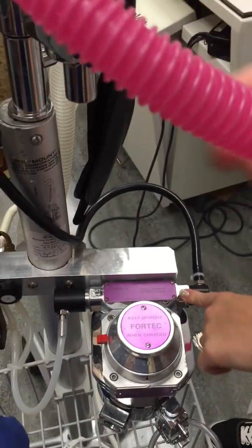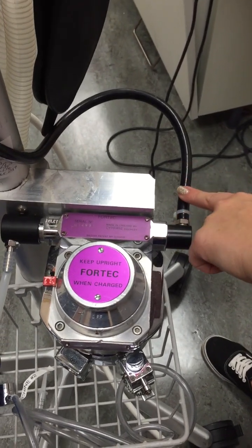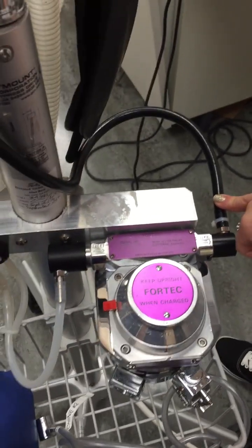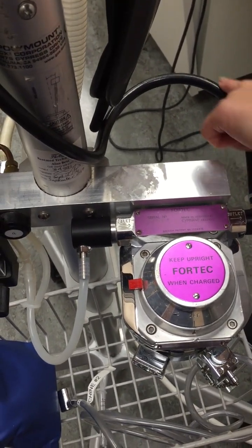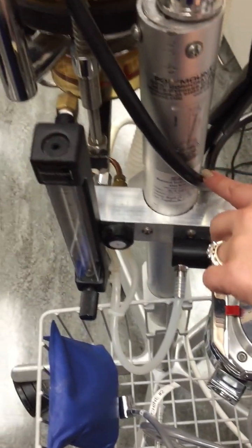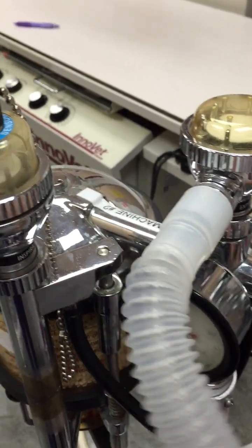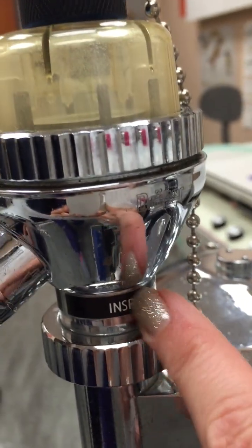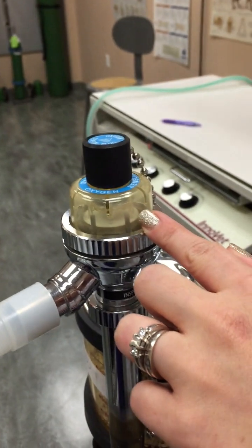All right, so from the vaporizer outlet, we are now coming and you have your fresh gas flow. So this is your oxygen and your isoflurane. You will notice your fresh gas flow come from this hose and come right up to this tube here. This tube here is your inspiration. It leads up here to your inspiration flutter valve.